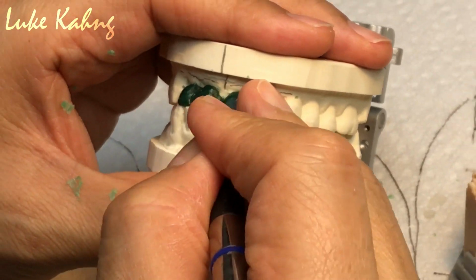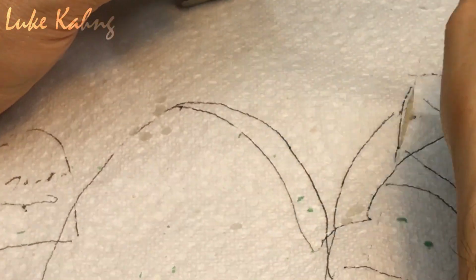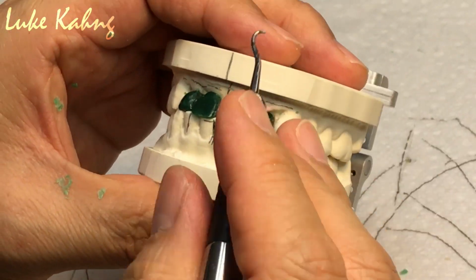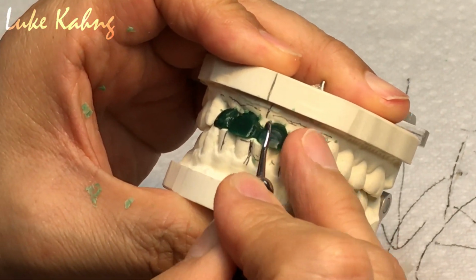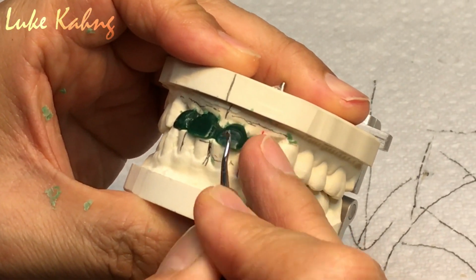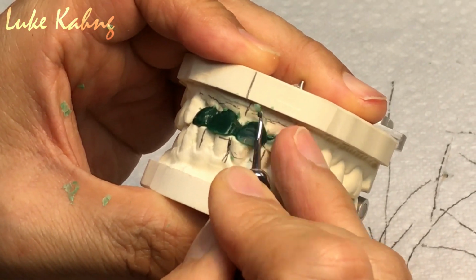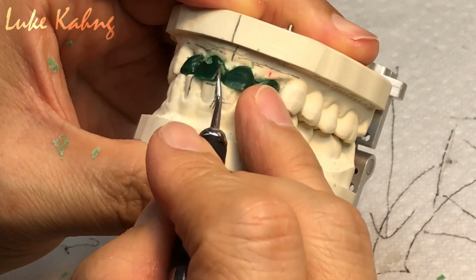So you have to give it a little bit more between the teeth. I need more embrasure like that so I can cut it. So what I did here, a little bit more opening. So whenever I build up the porcelain, I still have room, I do not have any problem. Make sense? Showing all the high opacity metallic crown, I don't like that.